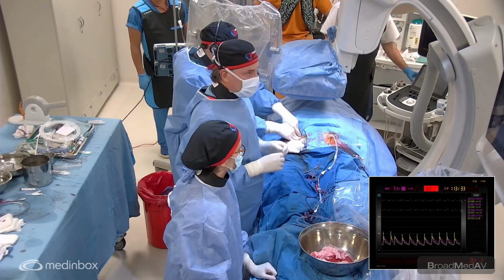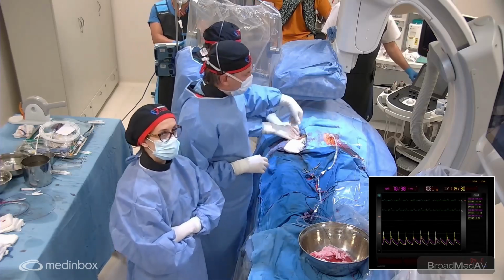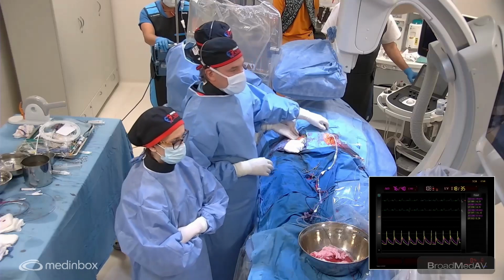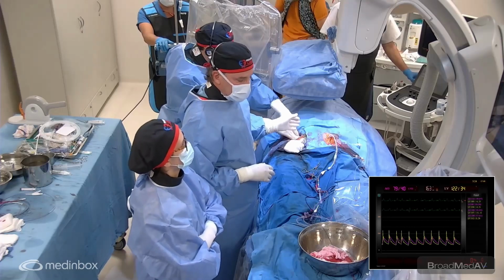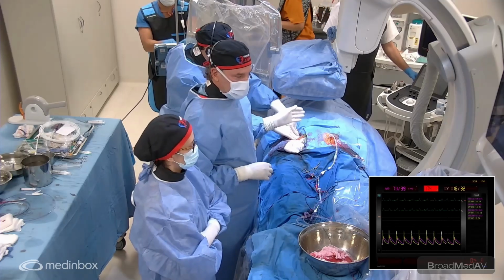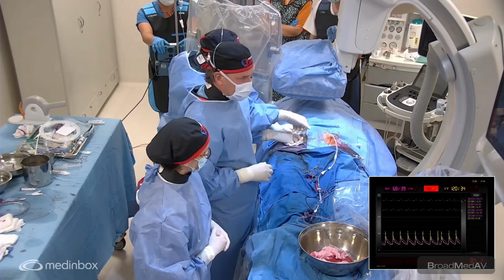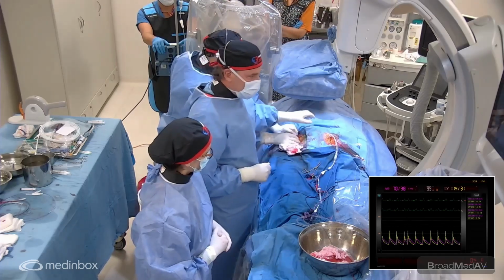In this patient, we decided to go with hypogastric embolization, going for contralateral. We deployed probably 8 or 10 coils, Concerto coils, into the hypogastric artery. After that, we advance from here the iliac branch, which is a bifurcated iliac device, especially for dilated iliac arteries. I showed you that we have a contralateral rail, so we can advance into the iliac artery because of this rail, because without this rail, it's absolutely impossible.